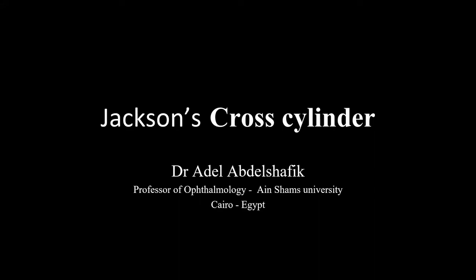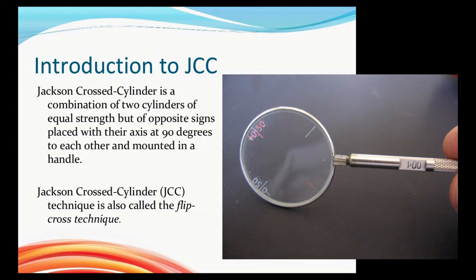This presentation is about Jackson's crossed cylinder. It is a combination of two cylinders of equal strength but of opposite sign, placed with their axes at 90 degrees to each other and mounted into a handle.